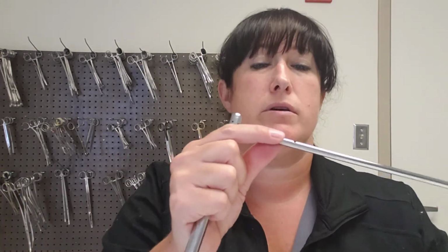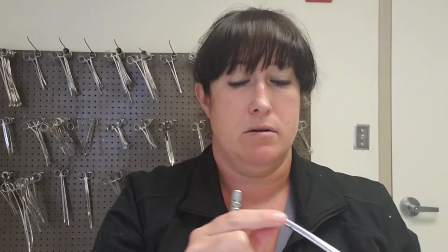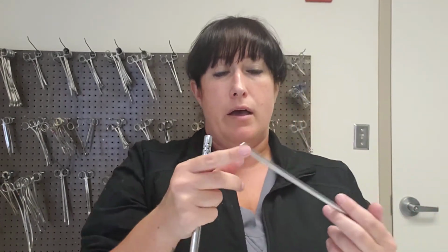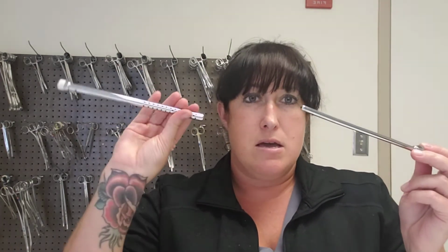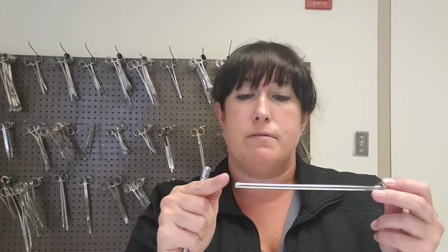And now you've only got one little hole here. I'm sorry. Okay, so there's 1, 2, and then there's a third one at the very tip. For vascular procedures, when very precise suctioning is needed, they may request that the guard be taken off and this be used for precise suctioning.